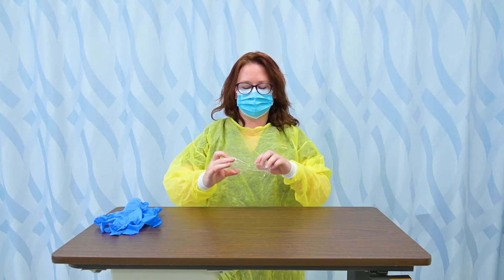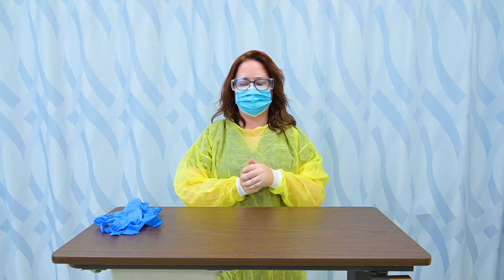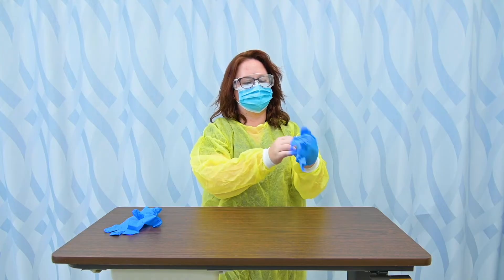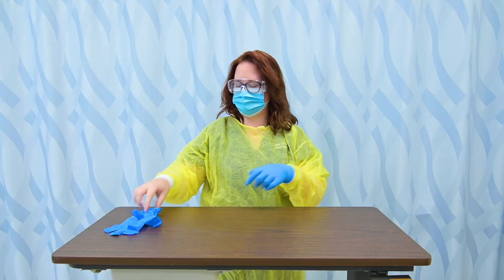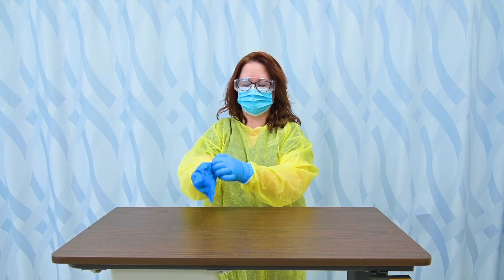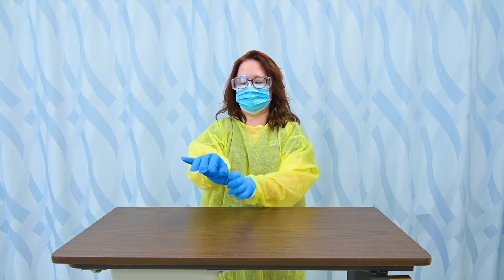Next, I'm going to wear eye protection. It's important to note that my glasses do not count as eye protection — I need to wear additional protection on top of my glasses. And the final step are my gloves. The gloves need to be pulled down so that they go over the cuff of the gown so that at no point would any of my hand or wrist or forearm be exposed to anything.